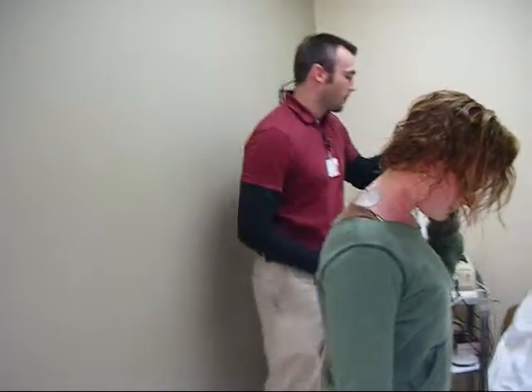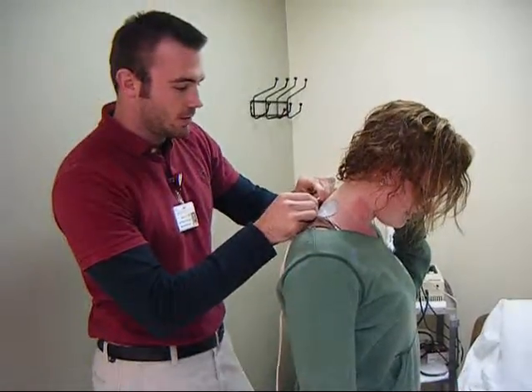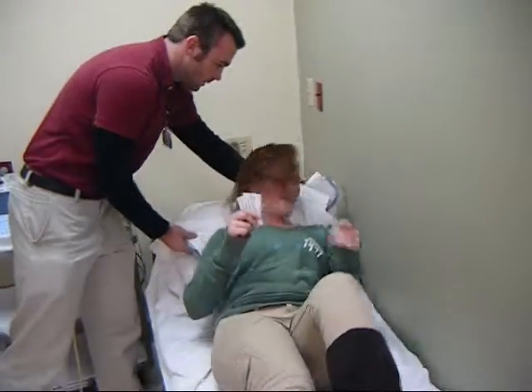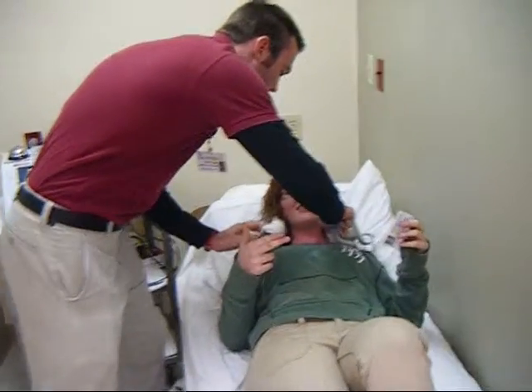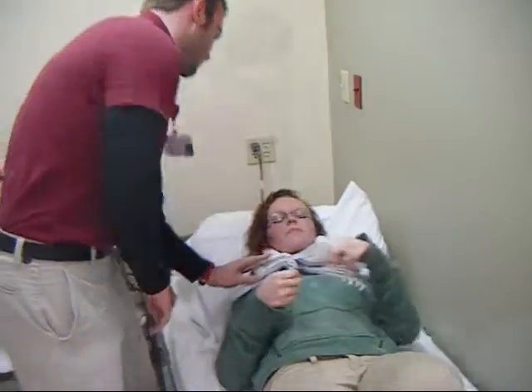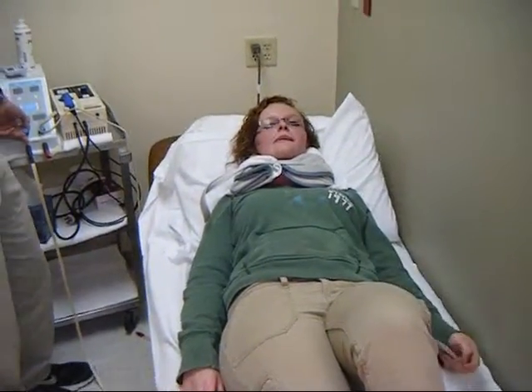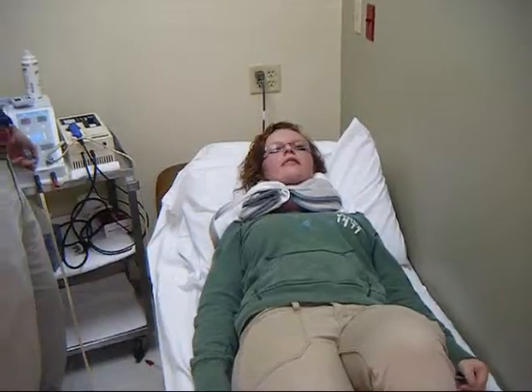So now it's time to plug you in — make you look like the Bride of Frankenstein! This is the reaction video. Unfortunately this does have to go around your throat and neck area. That's not too tight? What I want you to do is tell me when you very first start to feel it, okay? So again, it's going to be kind of like ants are crawling on your skin — definitely a weird sensation.